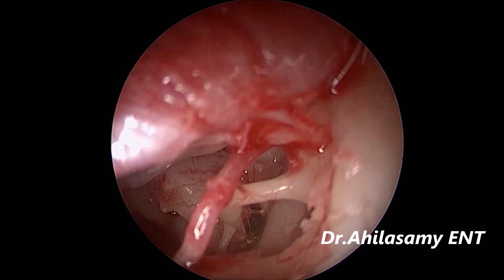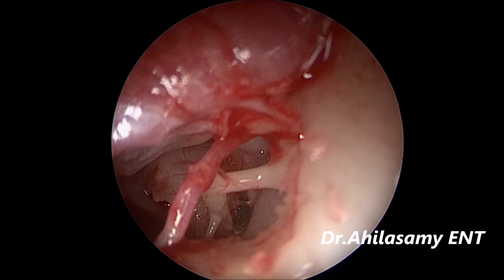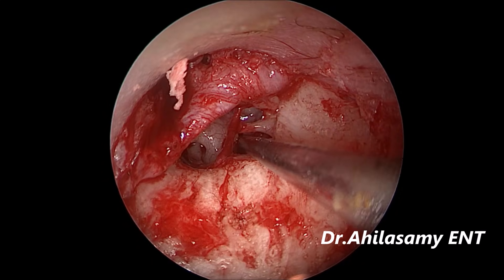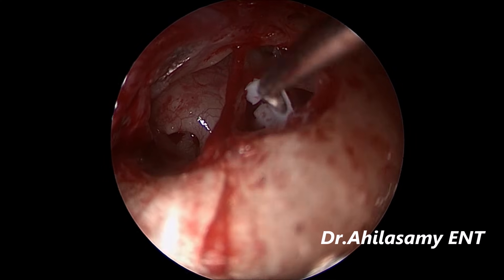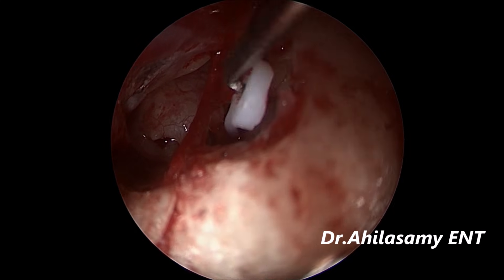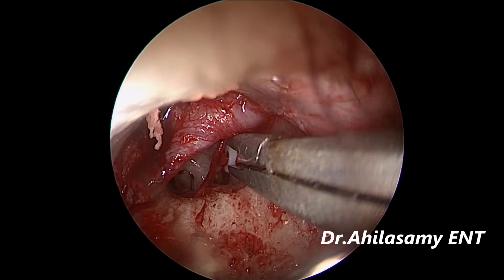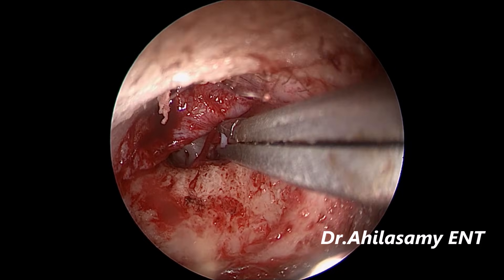Now you can see the full incus is exposed. The stapes, stapedial tendon, and footplate — everything. It is a thin footplate. I am making the perforation and then widening it. Now I am using the teflon piston which has been measured for around 4.5 mm. The chorda tympani has been preserved, and the piston is crimped. We check the hearing on the table and the patient has very good hearing. Then we close.